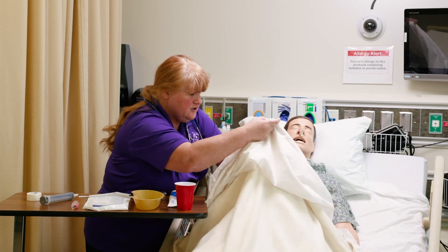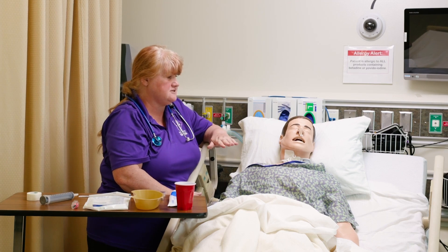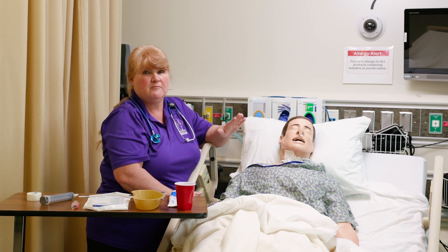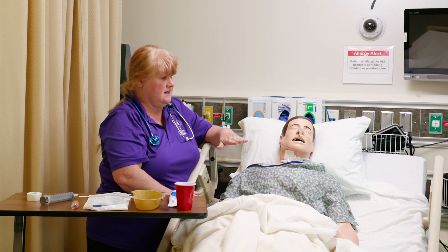Once that's done, you're going to explain the procedure to your patient. You're going to put a nasogastric tube down into their stomach. It will be uncomfortable, but once we get it down, they will feel a lot better.